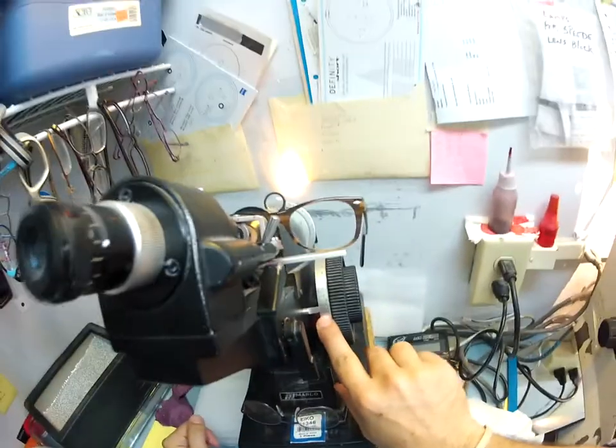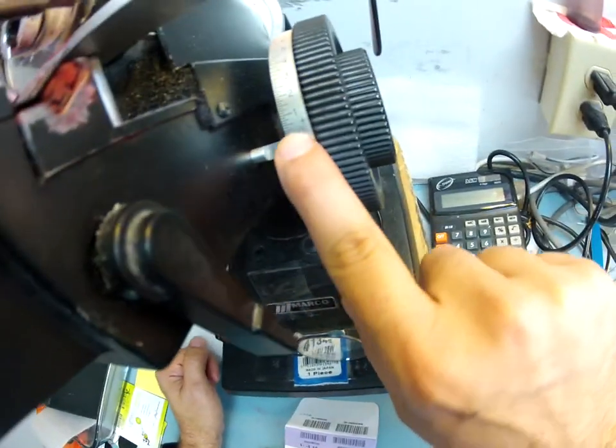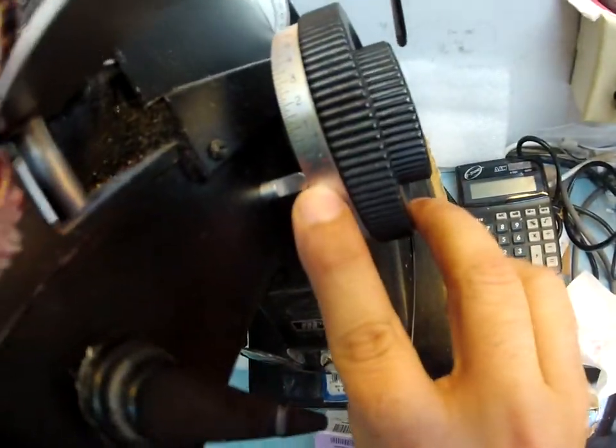I'm reading minus 50. 0 is plano, meaning nothing. Minus a quarter, minus 50, minus 75, 1. So I'm exactly halfway between 0 and 1. You have 2 steps of astigmatism correction. So I'm going to spin that to check, and now we're at minus 1 combined power.